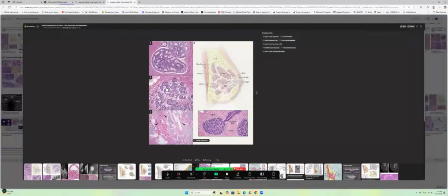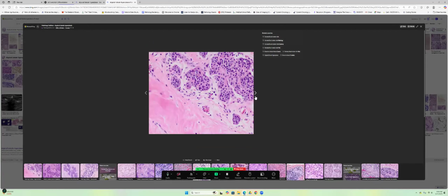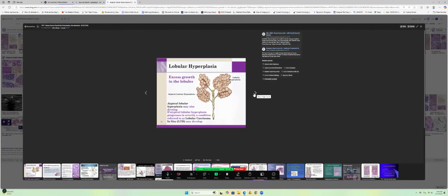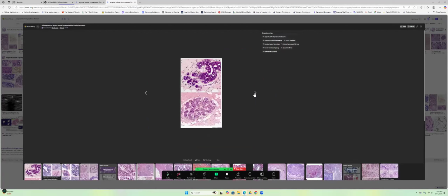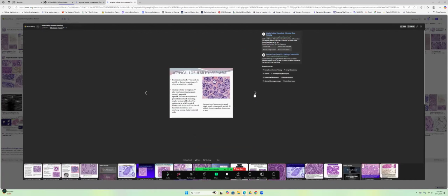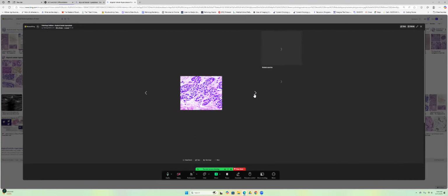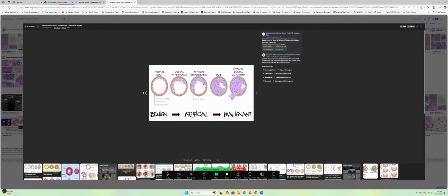You see, this is a terminal ductal lobular unit. These areas are all involved already. It's involved, but not very distended. Also, the cell population in the hyperplasia is not monomorphic. LCIS cells are usually monomorphic. Normal cells on the side will make it polymorphic. If it doesn't involve everywhere, some parts will not be involved.